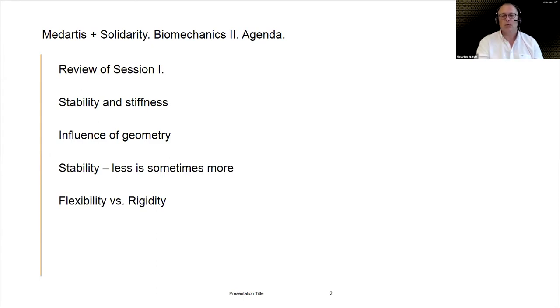Those things should not be confused. Lots of people think that if something is flexible, it's not stable enough to do the job, and it really needs to be completely immobile and completely rigid if you want a proper fixation. And I'm afraid this is sometimes not really true, because life is all about flexibility, elasticity. The way we are built, we are set up by elastic structures. Our bones are not rock solid, so when you load them, they tend to flex a little bit under load. And this is what I would like to highlight, that flexibility is a very important factor in that respect.